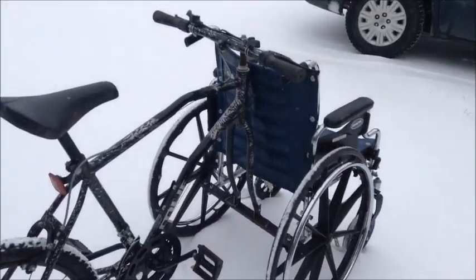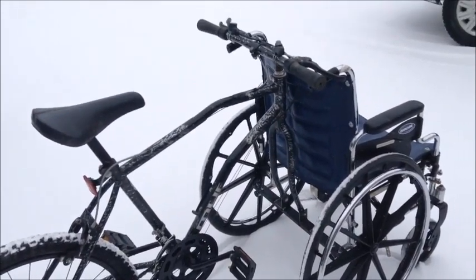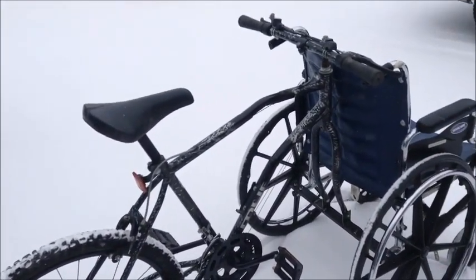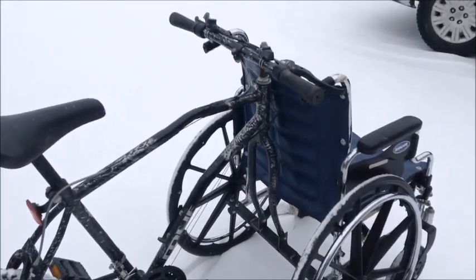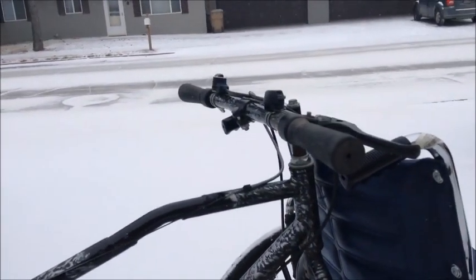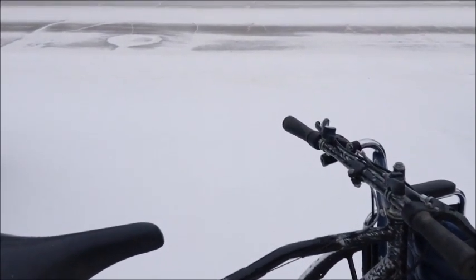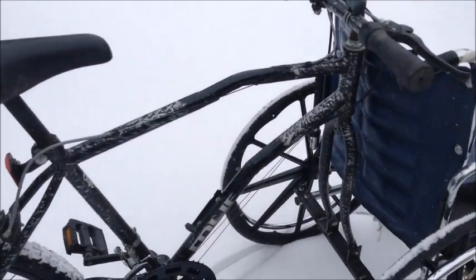And here's our end product. And heck, take someone for a ride, have some fun with it. But the number one key for the frame mod is you've got to get that headstock vertical. And you do that by notching and bending the neck forward there at the backbone and the down tube.